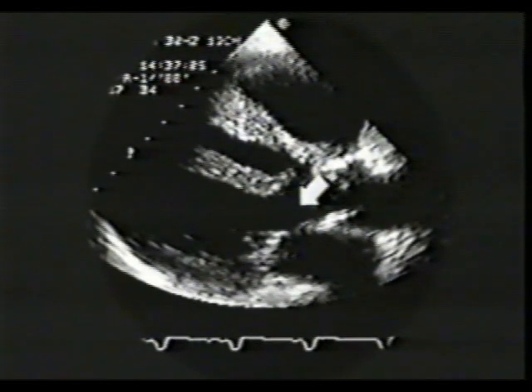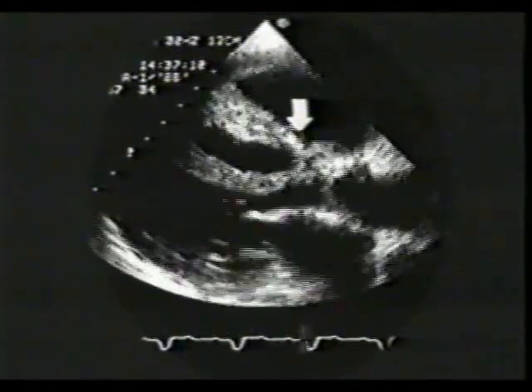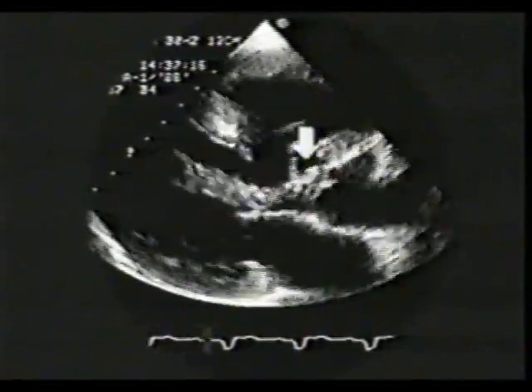Left ventricular outflow tract is widely patent, and left ventricular cavity dimension is normal. Watch these features in real time now. In real time, you can also appreciate that a portion of this redundant tricuspid apparatus is prolapsing through the ventricular septal defect.